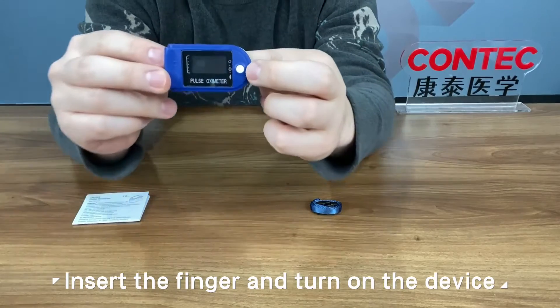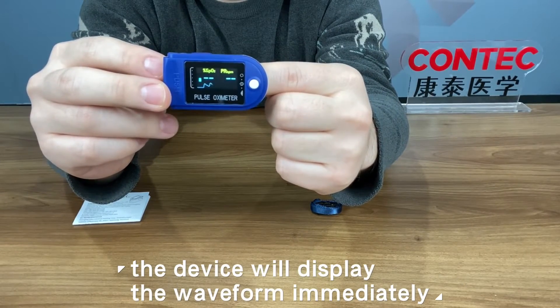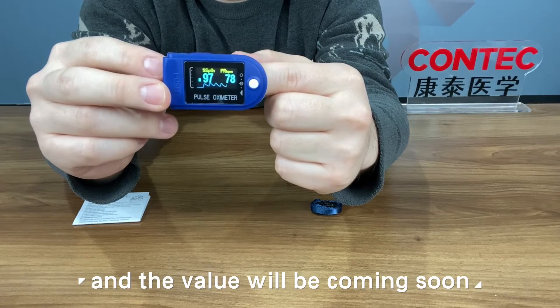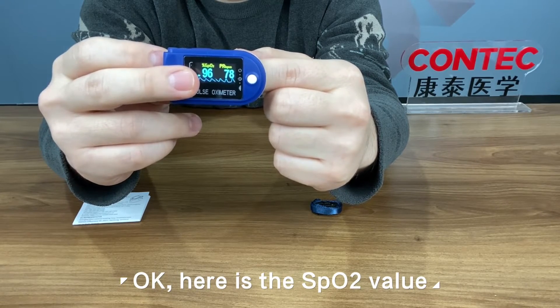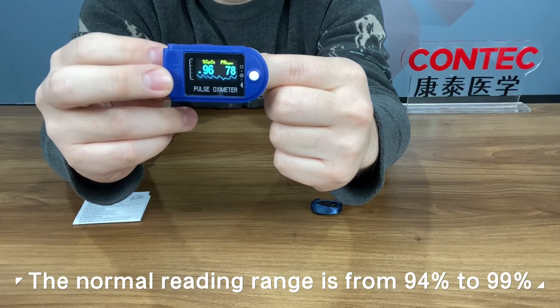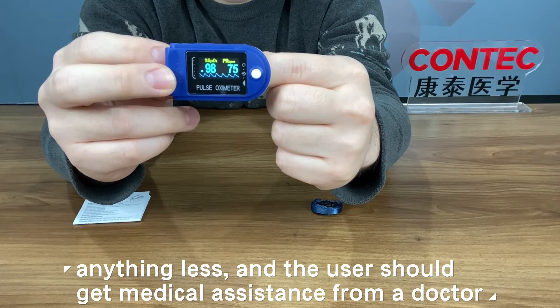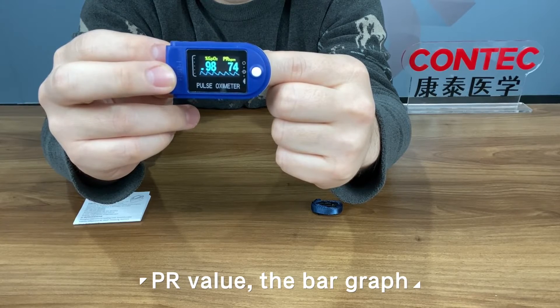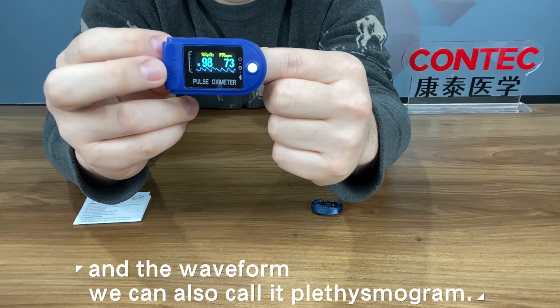Insert the finger and turn on the device. The device will display the waveform immediately and the value will be coming soon. Here is the SPO2 value. The normal reading range is from 94% to 99%; anything less and the user should get medical assistance from a doctor. If you want to use the oximeter, the bar graph and the waveform — we can also call it plethysmogram — are available on screen.